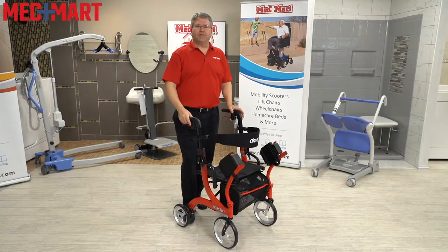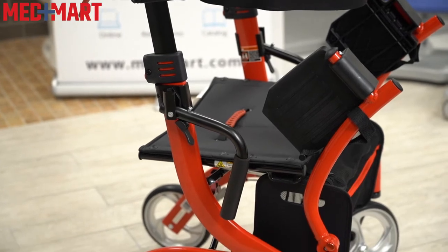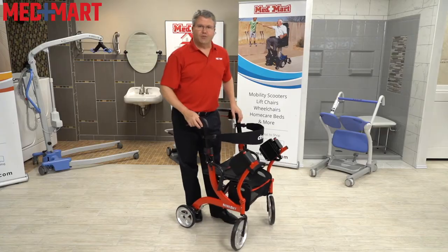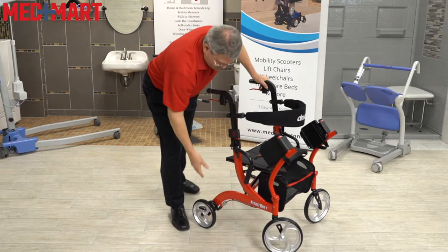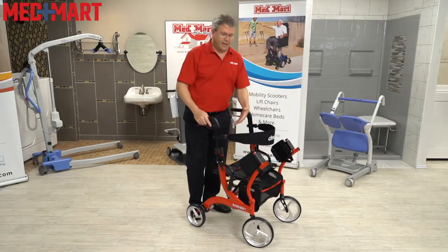Hi, my name is Jeff. I'm a product specialist here at MedMart, and this is the Drive Nitro Duet, which combines the mobility of a rolling walker and the convenience of a transport chair. Just like the entire Drive Nitro line, we have a very aesthetic-looking, very sturdy frame. All the cables are embedded into the frame, which makes it very easy to move around without accidentally catching the cables on something.